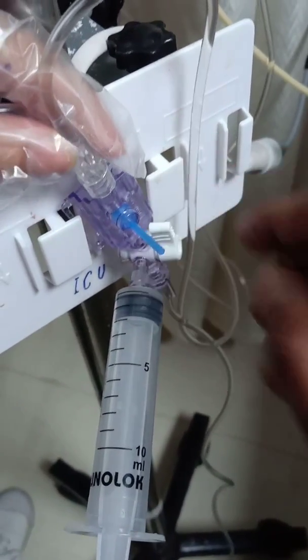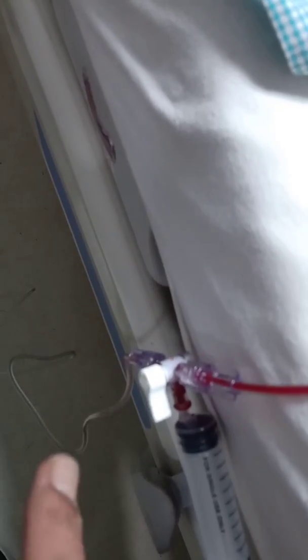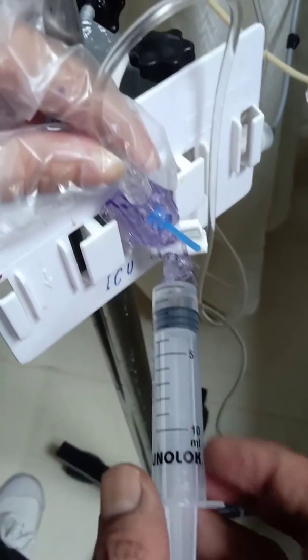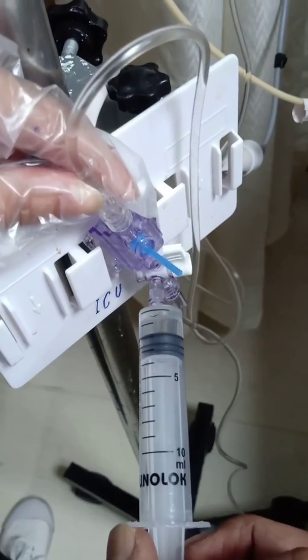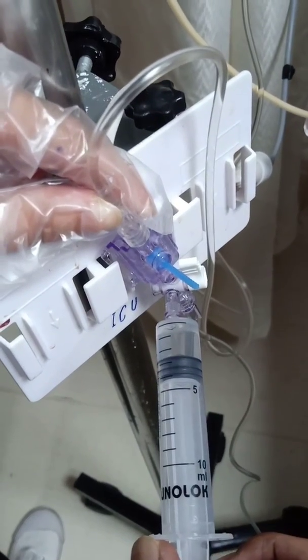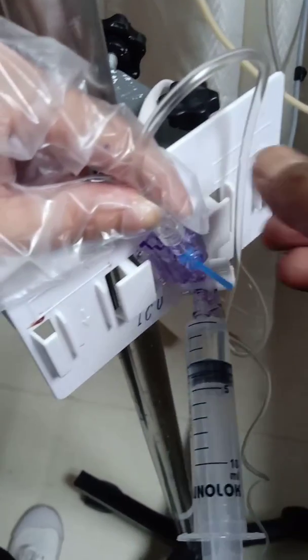We open the port and flush fluid comes in; you can see the blood coming out through the line. Once it reaches the syringe we have withdrawn around 1.5 ml of fluid, so we withdraw another 1.5 ml until we reach the 3 ml mark, then stop and close the port.